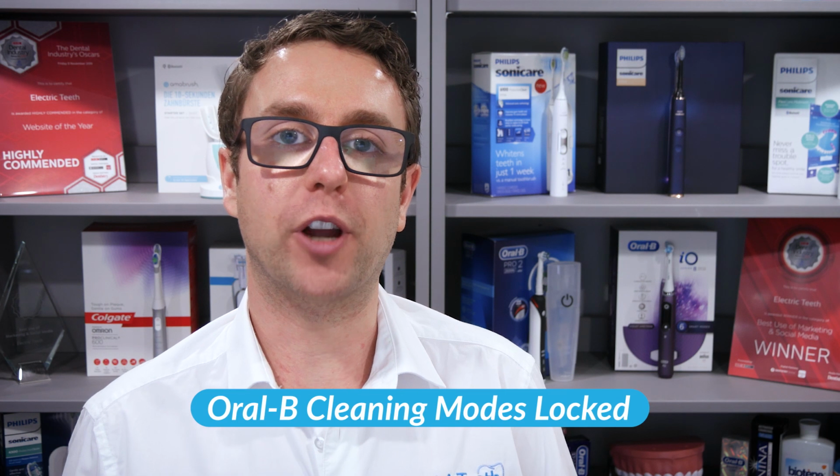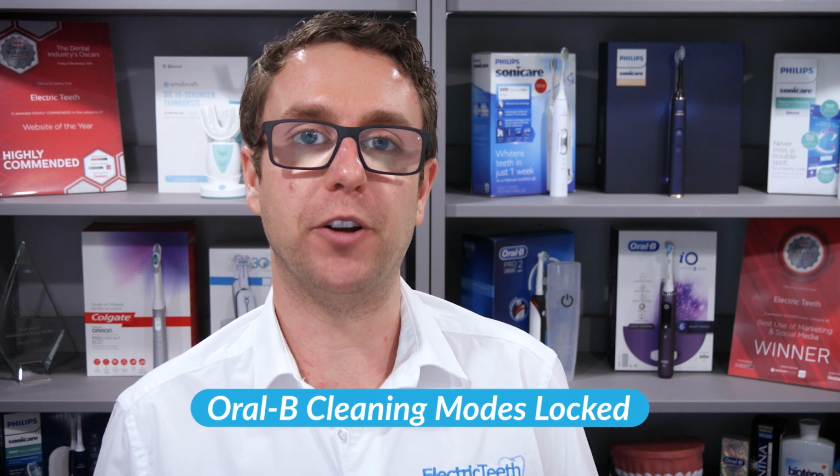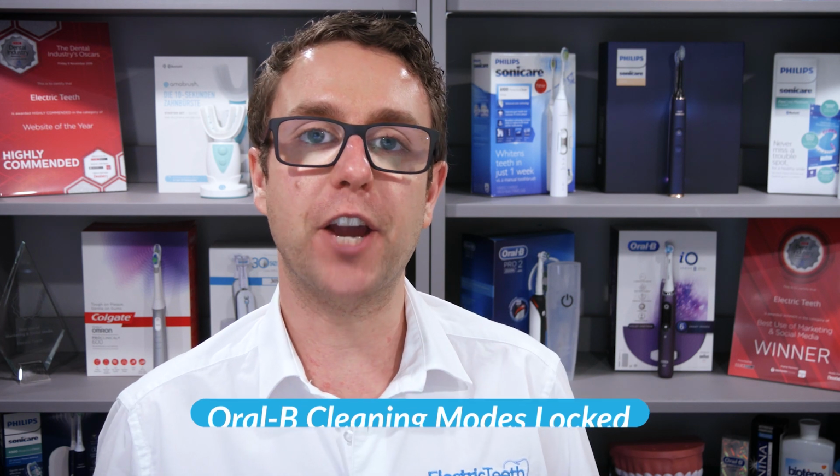Do you have an Oral-B electric toothbrush where certain cleaning modes are no longer available? They're locked. You were previously able to access a particular mode and now you can't. In this video, I'm going to explain how you can gain access to those modes once more.